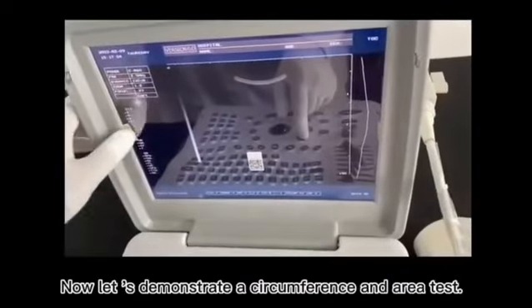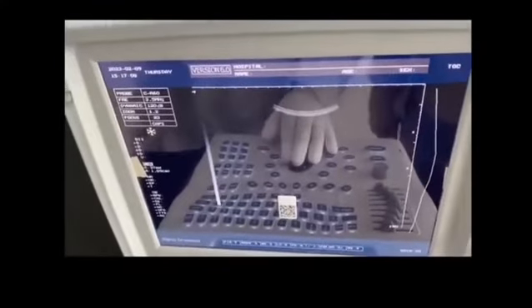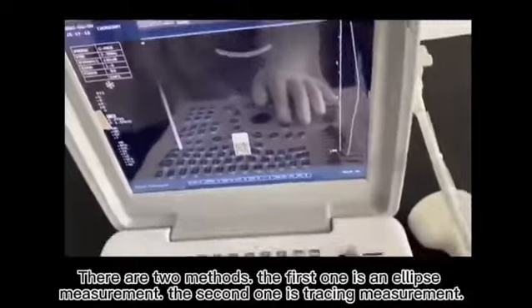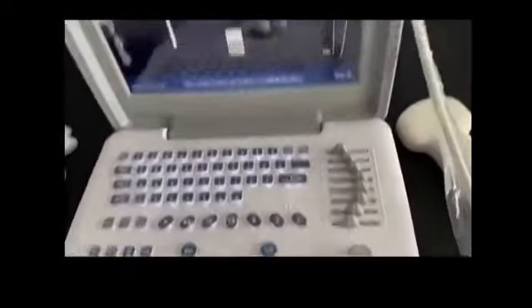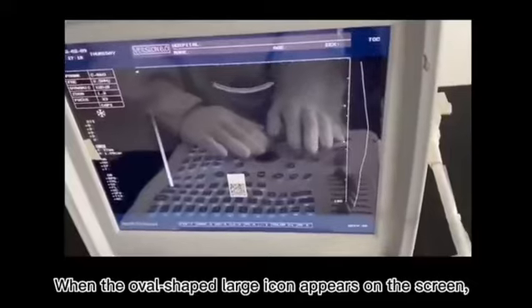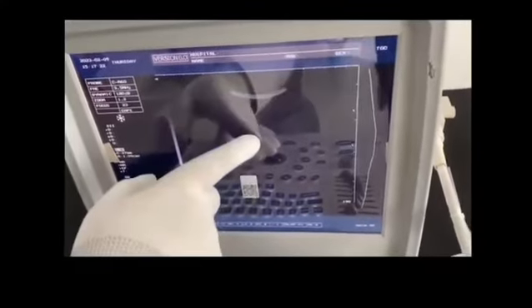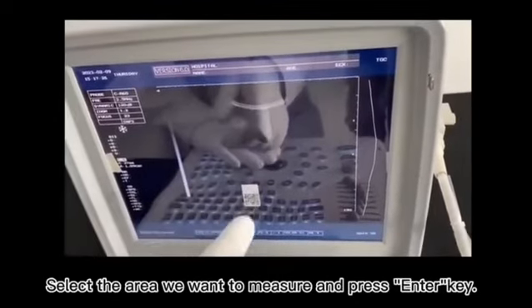Now let us demonstrate a circumference and area test. There are 2 methods. The first one is an ellipse measurement. The second one is tracing measurement. When the oval-shaped large icon appears on the screen, select the area we want to measure and press the Enter key.